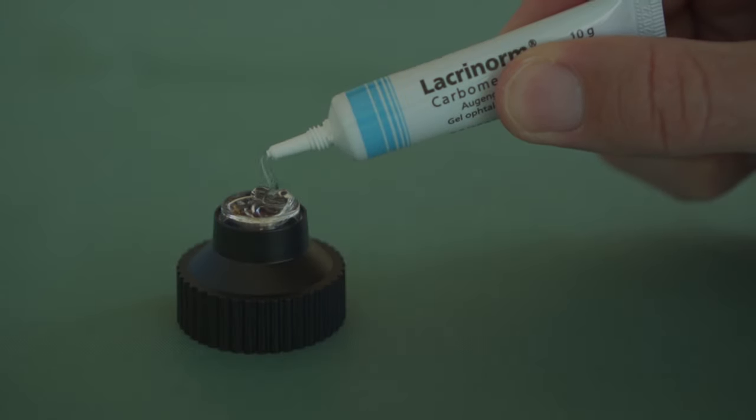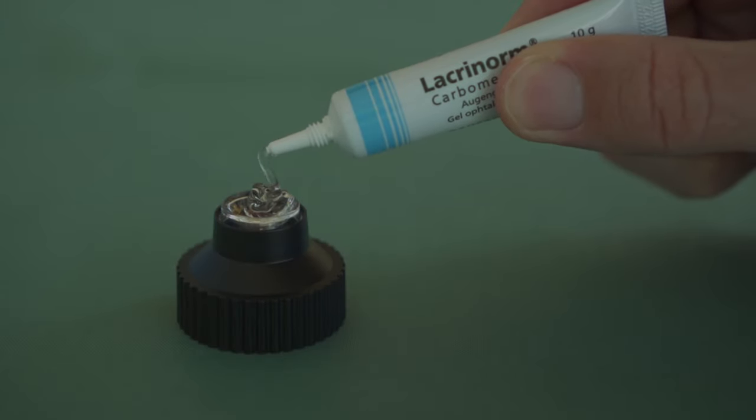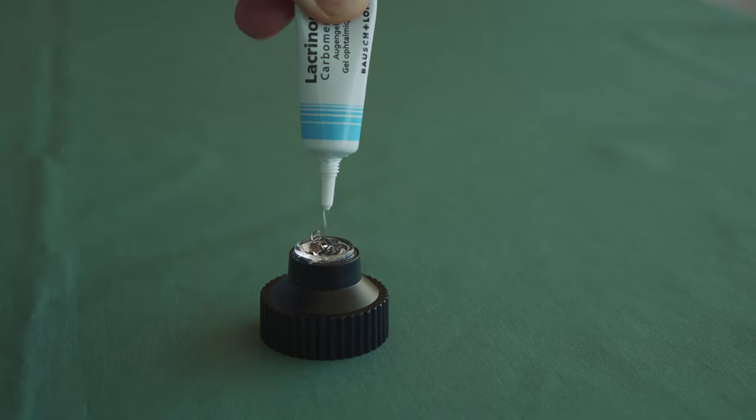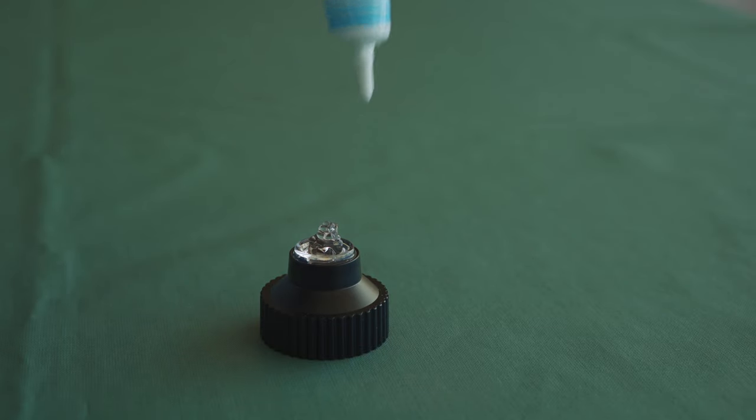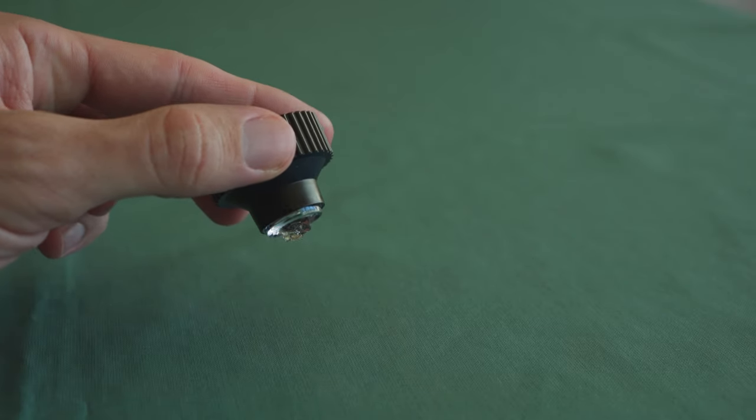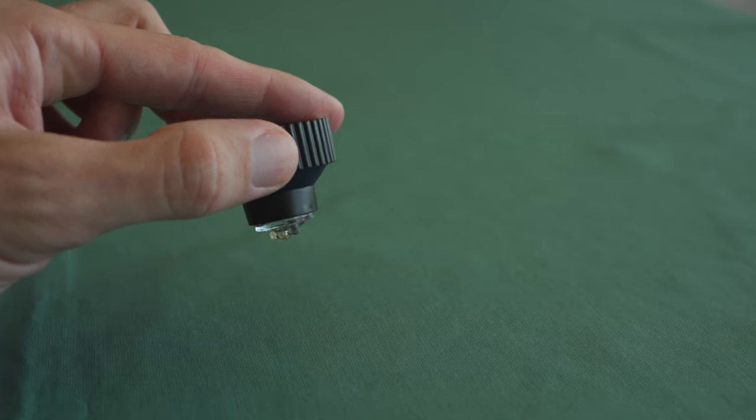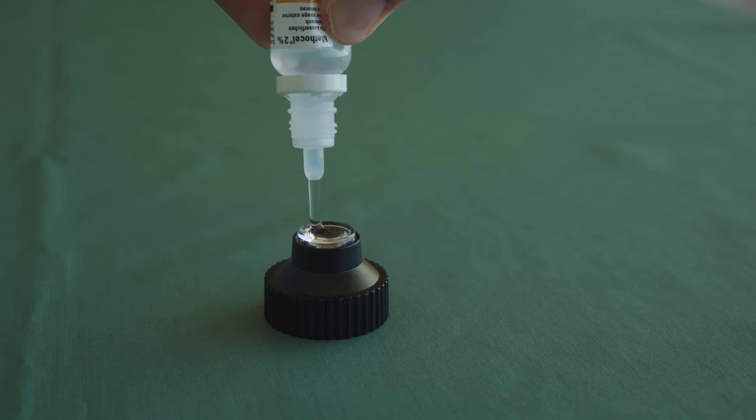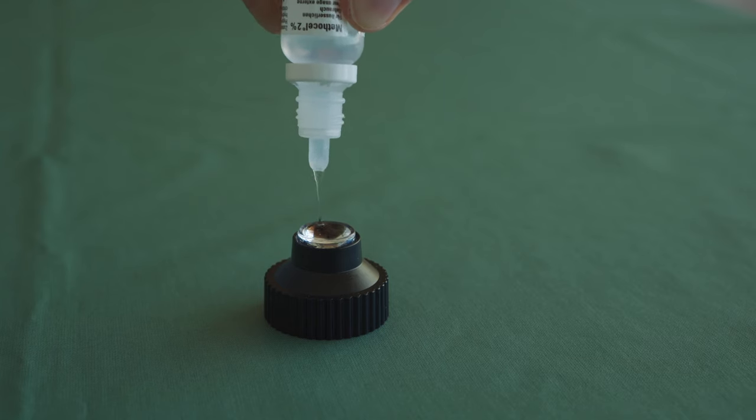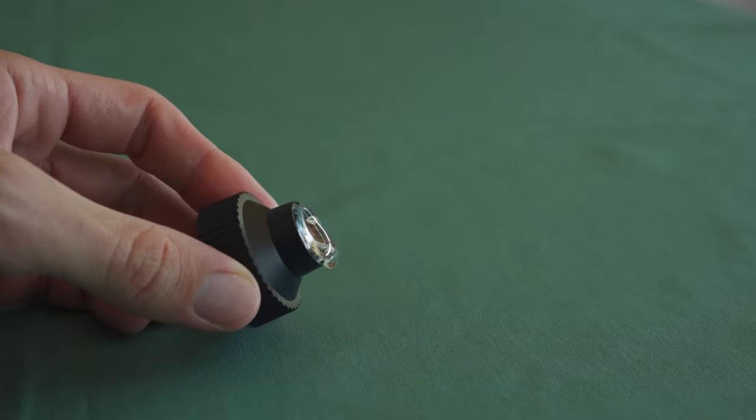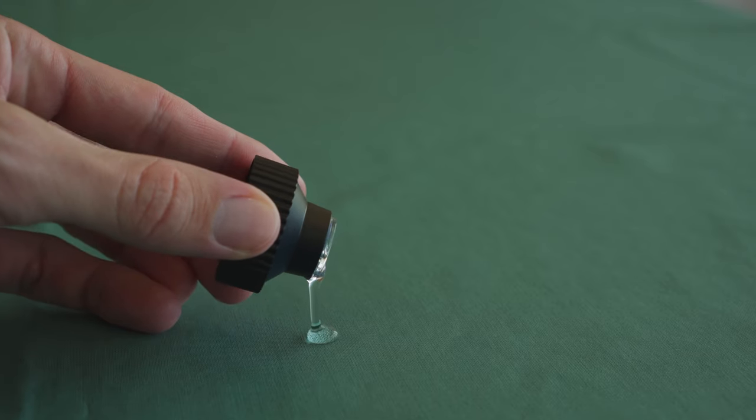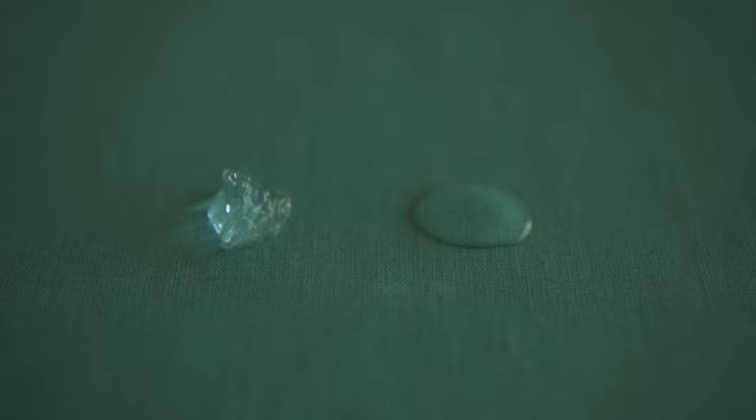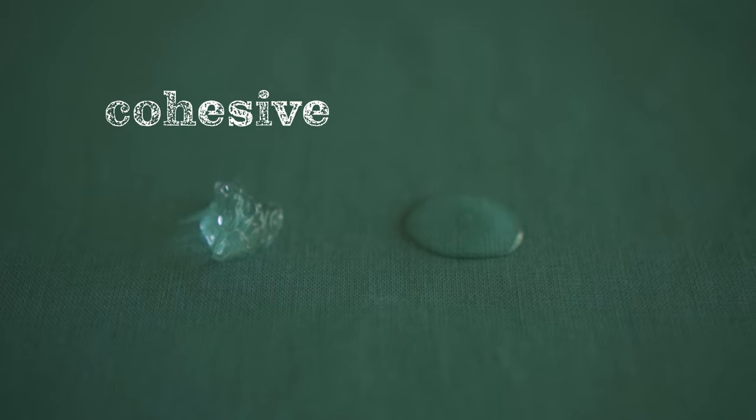Then you need to put some kind of lubricant on the lens so you don't scratch the patient's cornea. There are two types of lubricants: cohesives and dispersives. The cohesive ones have the advantage that they stay on easily even if you turn the lens upside down, but they have the disadvantage that they can form bubbles. Dispersives, on the other hand, almost never have air bubbles, but if you have trouble putting the lens into the patient's eye, they can run off your lens before you even have it on the eye. So usually for beginners, I recommend cohesive lubricants.